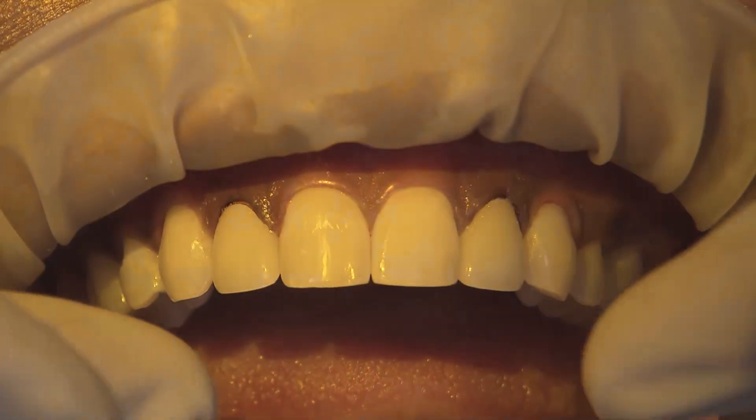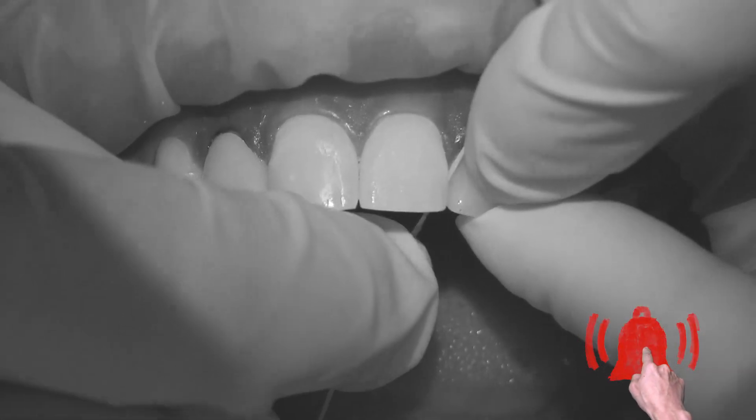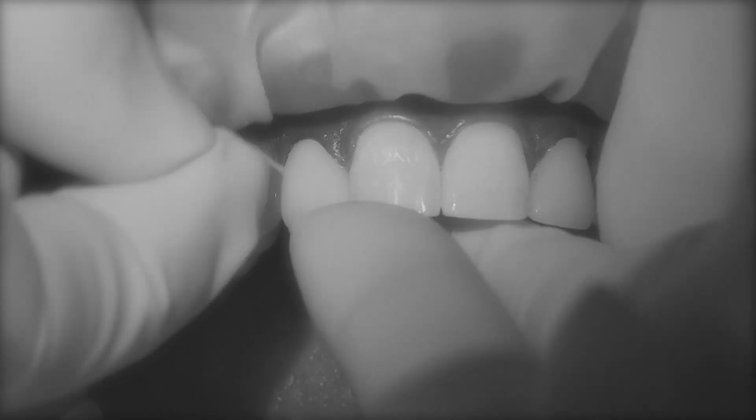With a tack cure of about 3 seconds on the facial and lingual, the excess cement enters a gel state for easy removal. After flossing to remove any excess interproximately, we final cure for 20 seconds per surface.